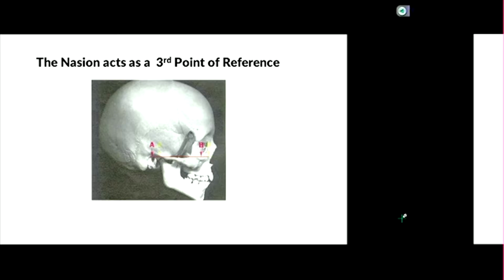Yes? So when you took the face bow out, I noticed this part was adjusted. Yeah. So how do you know where that goes? So the idea is that this part goes back and forth, obviously because it's got to clear the nose. And then once you bring it up to the right level, this will actually touch here. So once you've locked, remember the screws that are down here? Once you've locked that position in, this is no longer consequential. It's just, for the time being, it helps you orient.